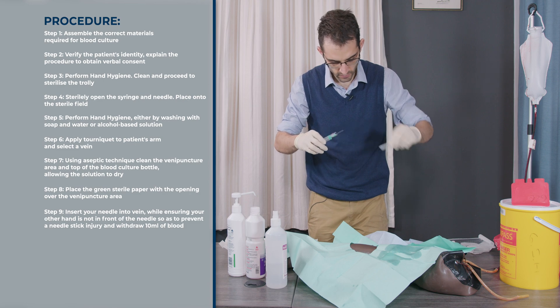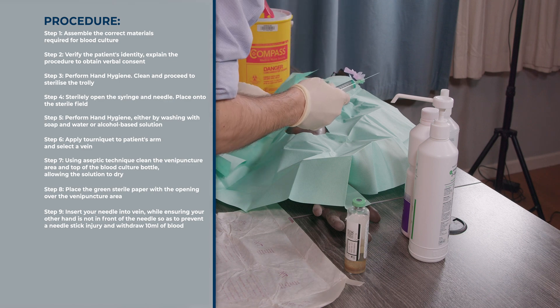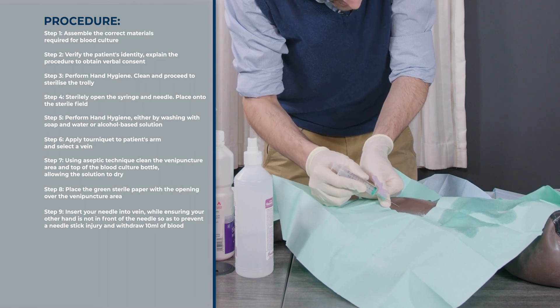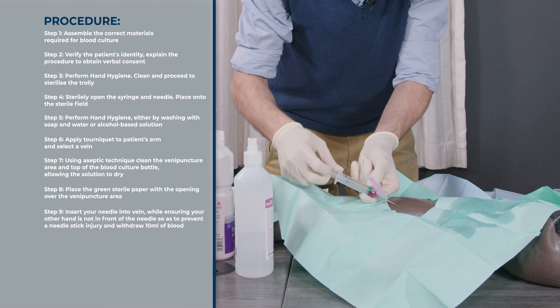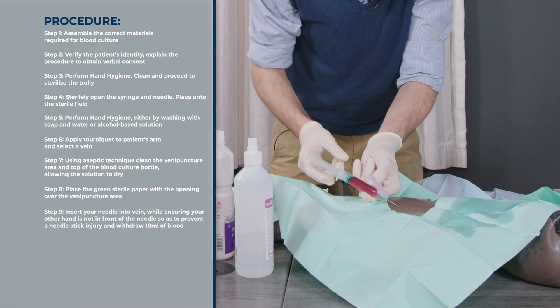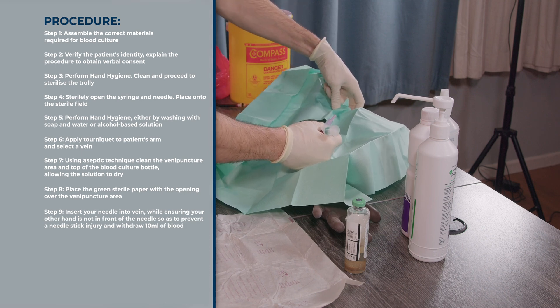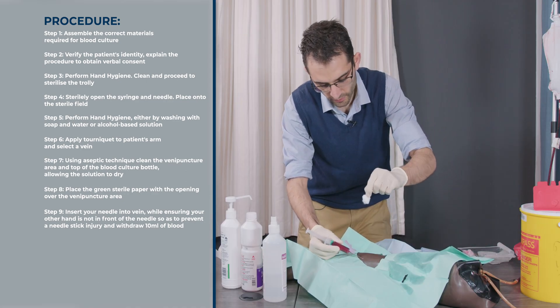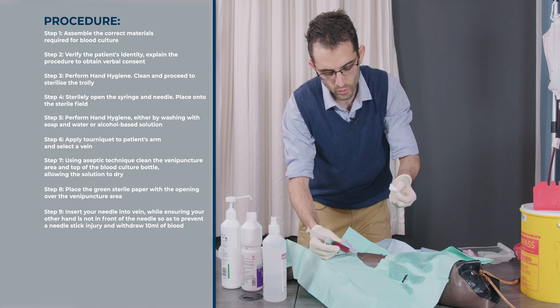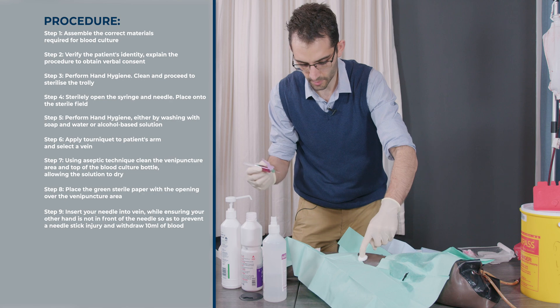Please don't prick yourself. It's important that you don't go and palpate the vein again — you've already identified your vein. Anchor the vein with your thumb and then enter into the area in a swift motion. Take about 10 ml of blood per blood culture bottle. Then undo your tourniquet. Do not put the cotton on top of the needle, as there's a risk of a needle stick injury and you don't want to contaminate the needle that you're going to put in your blood culture bottle. Quickly remove the needle from the arm, apply the cotton and pressure.